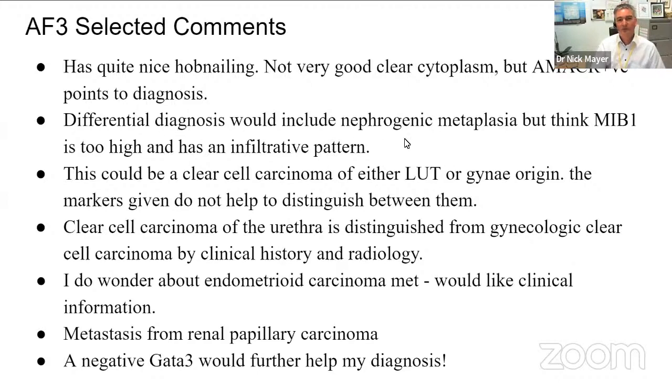So differential diagnoses include nephrogenic metaplasia, but, sorry, my thing's in the way, the MIB's too high and the tumor has an infiltrative pattern, and both of those things should make you very wary about calling this nephrogenic adenoma.